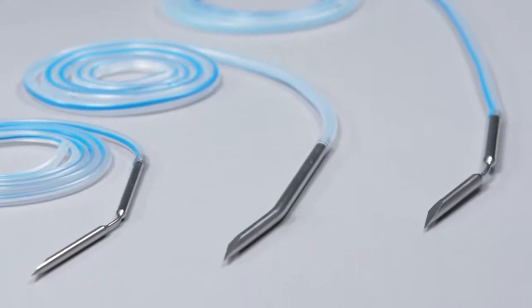I use Blake drains on all my procedures. I feel that the Blake drain provides at least as good drainage as a regular chest tube.